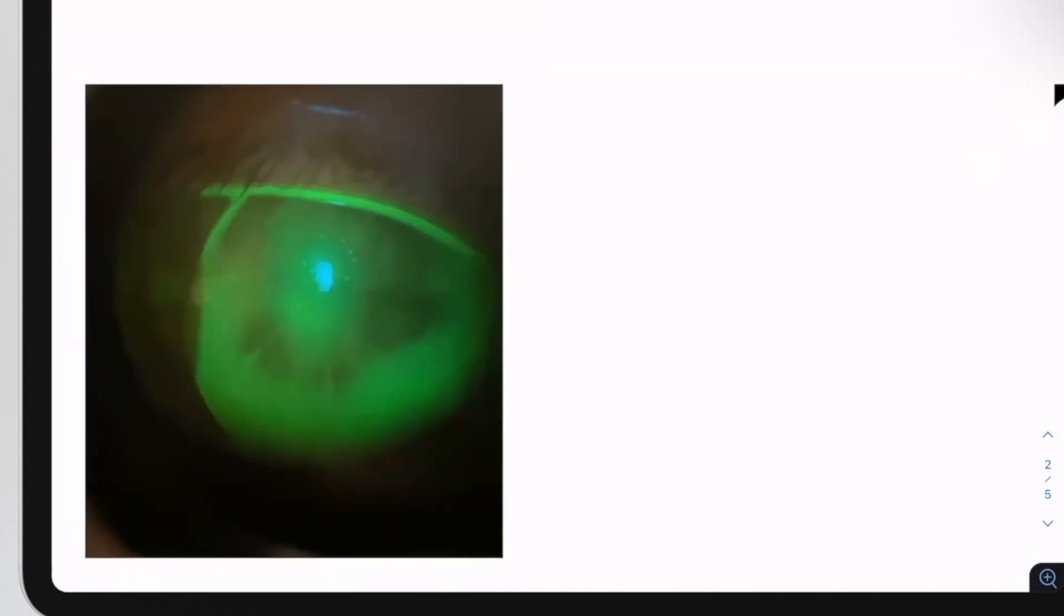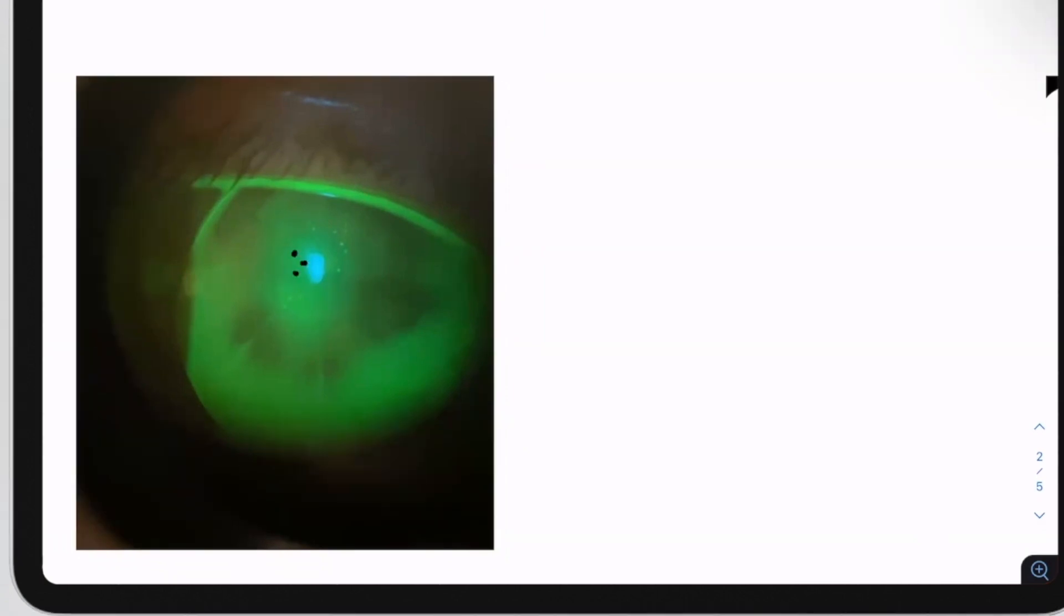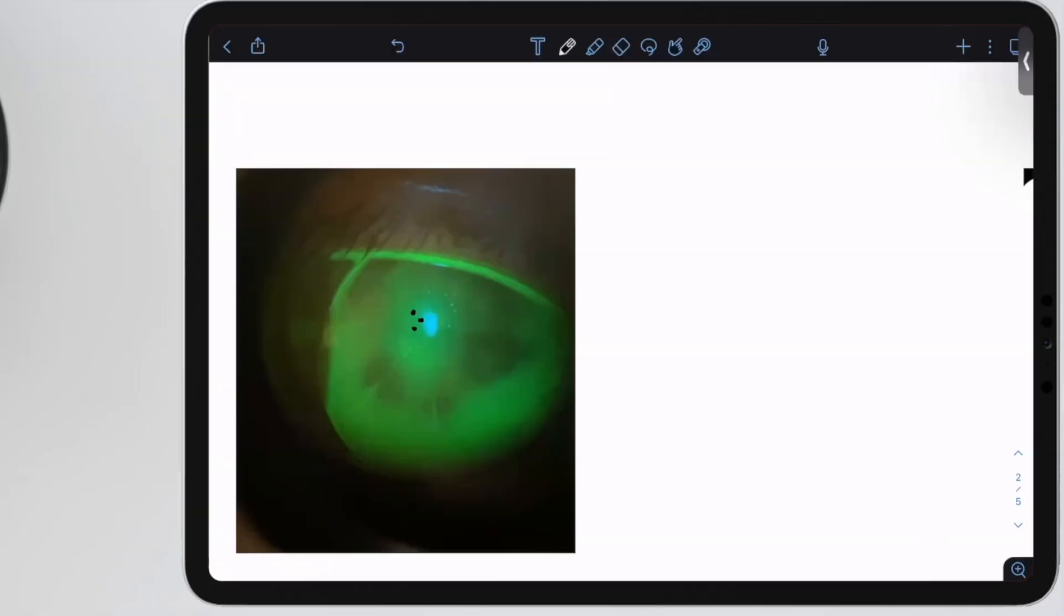In some cases of these steep fits, you're going to get something called dimple veiling. You'll remember that's when you get these little tiny bubbles of air that come underneath the center of the lens.